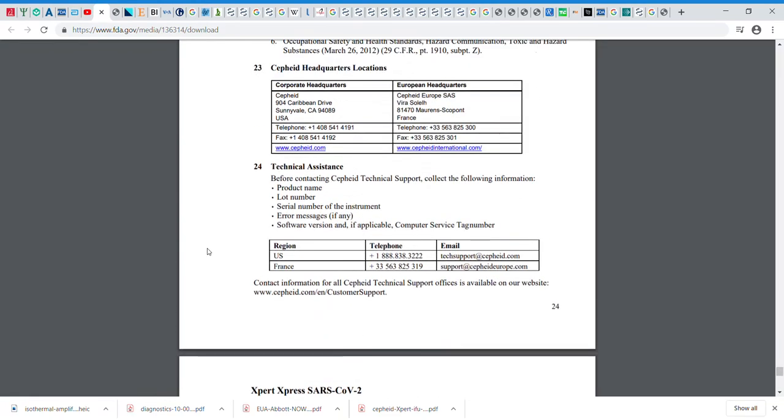So I think there are a lot of people that have started testing both of these things. They have different machines, they try the different machines. A lot of these big labs could do all this testing themselves, and the gold standard is obviously the PCR, and they have that. And so they compare it to the PCR in their big humongous machine and see how these more point of care tests work. Some people are saying the Abbott test is good enough, some people are saying it's not catching a lot of the people that have low levels. And so they're saying the Cepheid test is a lot better. But these are both American companies. These are both companies that are, quote, supposed to be pretty good.